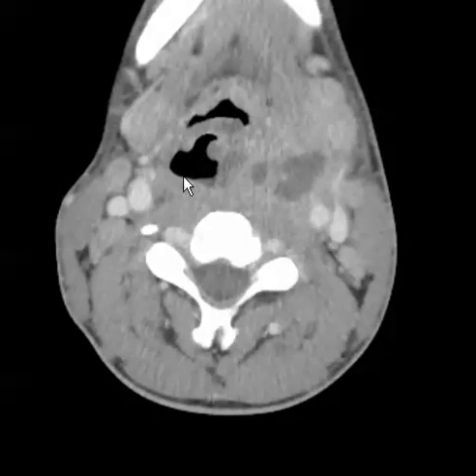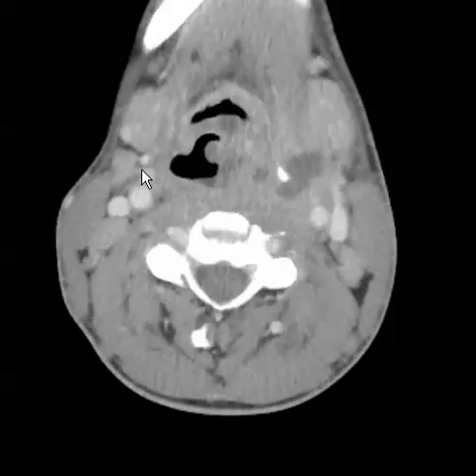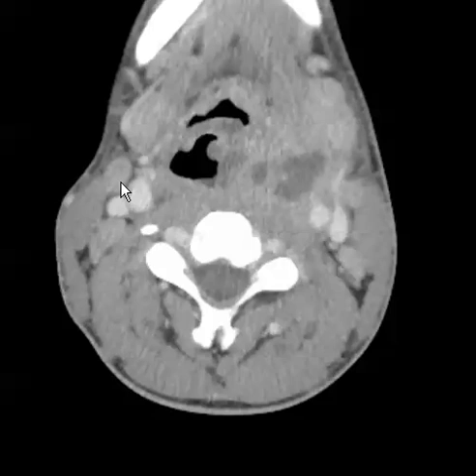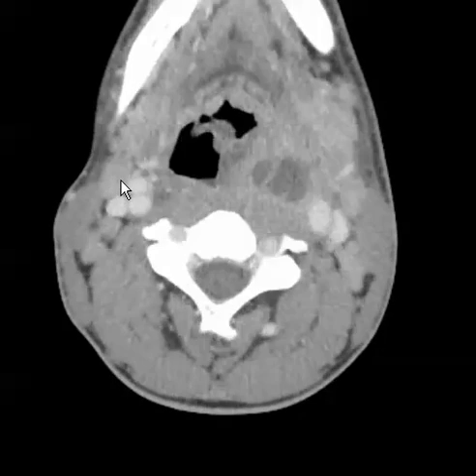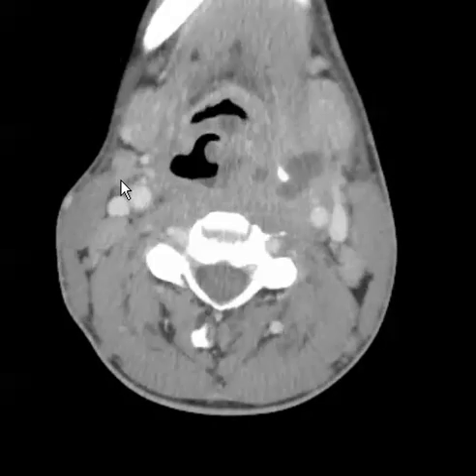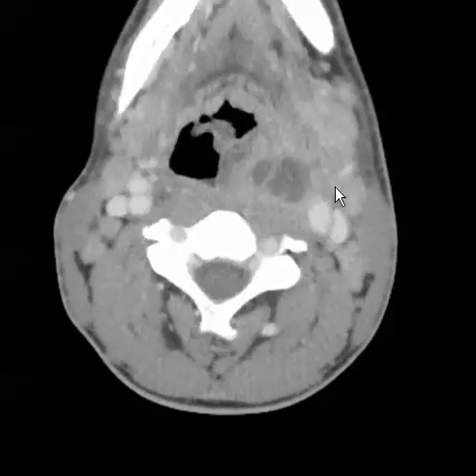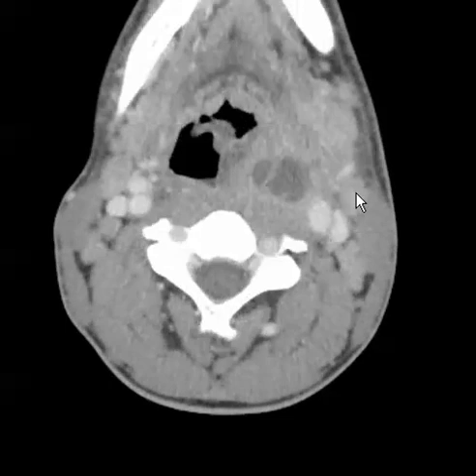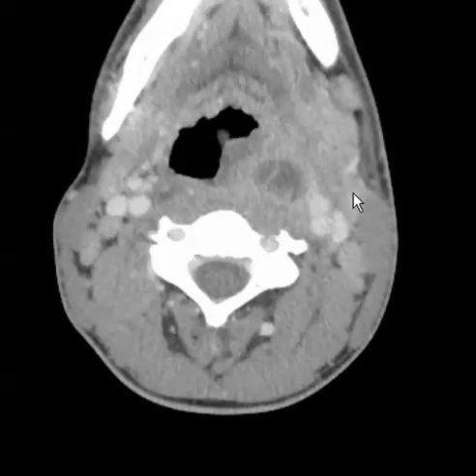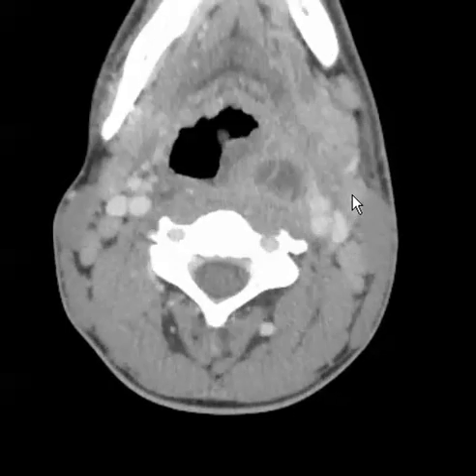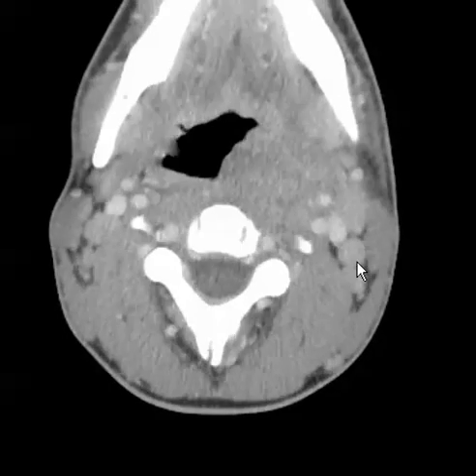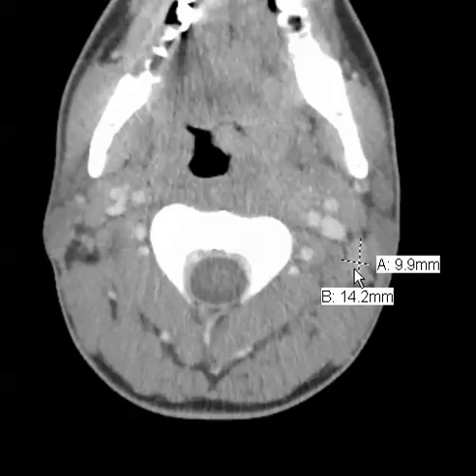It is also important to look at reactive nodes. Here we see a right level 2 reactive lymph node that is definitely greater than 1.5 centimeters. Here we see a reactive left level 2 node that is greater than 1.5 centimeters. We also have left posterior triangle nodes that measure up to 14 millimeters.